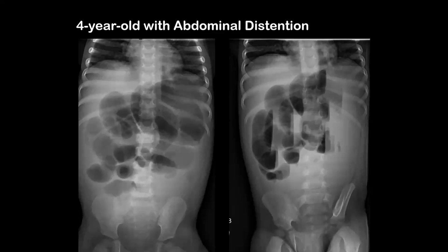This is a 4-year-old with abdominal distension. We were talking about how the bowel loops shouldn't be more than the interpedicular distance of the lumbar vertebral body, and we can see that these very much are. These are a lot of dilated small bowel loops. We don't really see any gas in the colon or in this left lower abdomen.